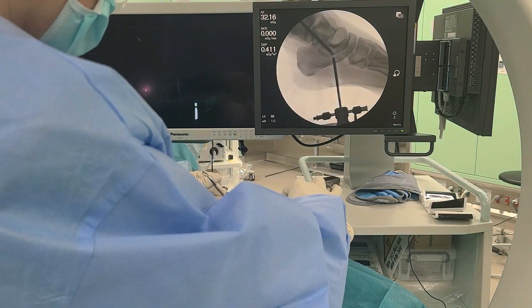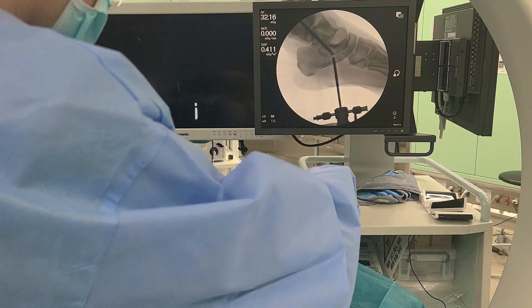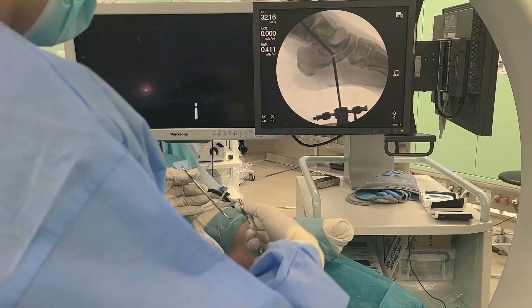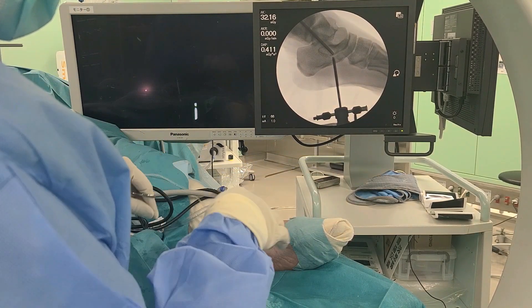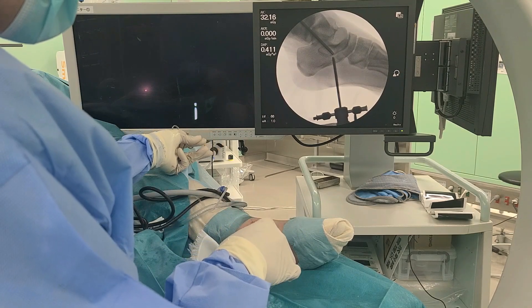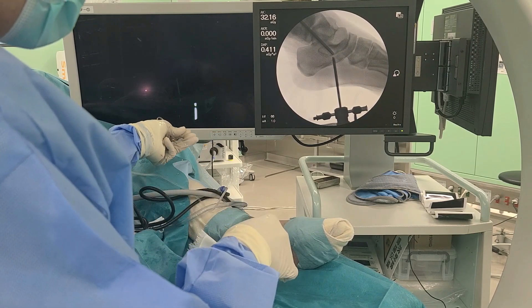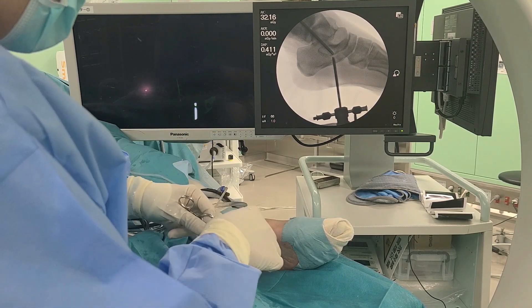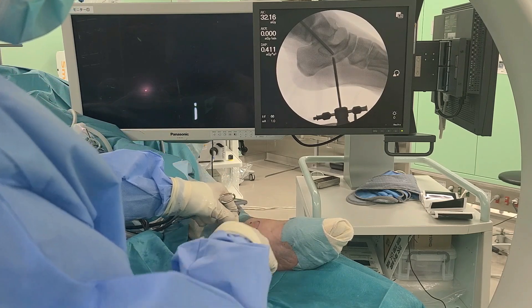The skin incisions are sutured with 5-0 nylon. Postoperative care: full weight-bearing with a below-knee splint is initiated one day postoperatively. The splint and sutures are removed 3 weeks postoperatively. Jogging is initiated 10 weeks postoperatively, and the patient is allowed to freely participate in sports activities 12 weeks postoperatively, as tolerated.